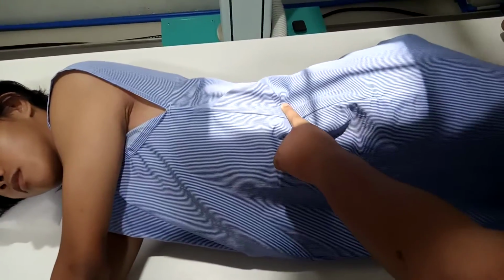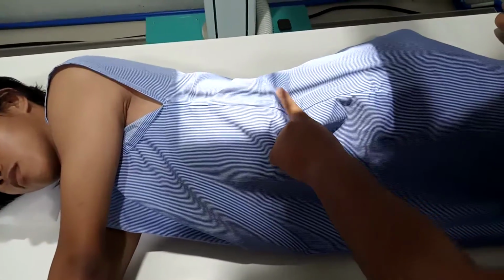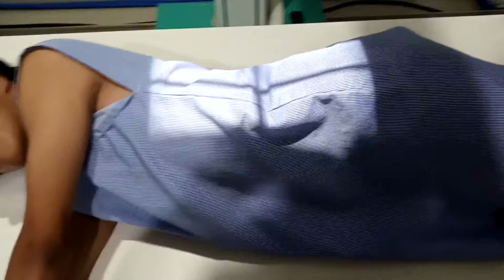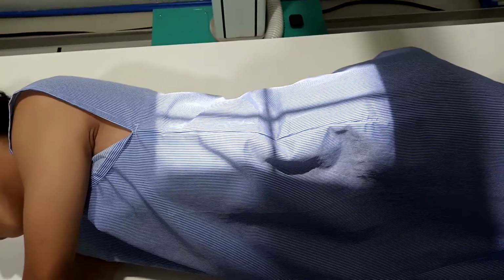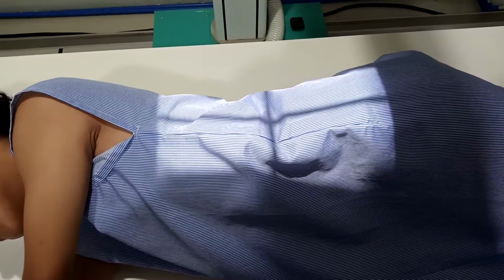Center it. Then, in collimation, adjust to 8 by 17 inches or 18 by 43 centimeter, then place the side marker in the collimated exposure field. The SID that we're going to use in this position is 40 inches or 102 centimeter.